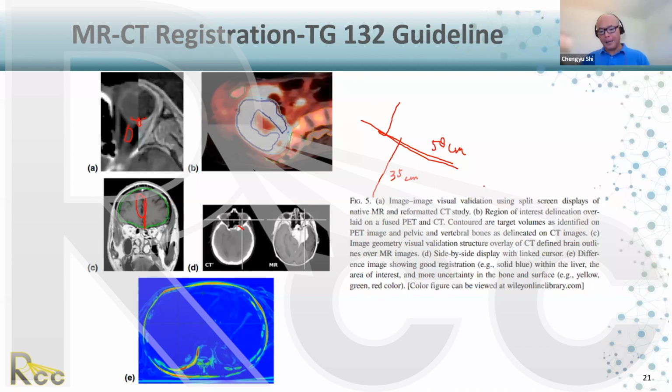You can dry run it if you ask a therapist to check it for you. Or move the isocenter. The isocenter doesn't need to be exactly the same as the marked isocenter at treatment. You can move it during treatment planning to avoid the setup collision. If unfortunately you still have a collision, because the patient's arm position may be different, then unfortunately you have to replan it, and there are no other choices.